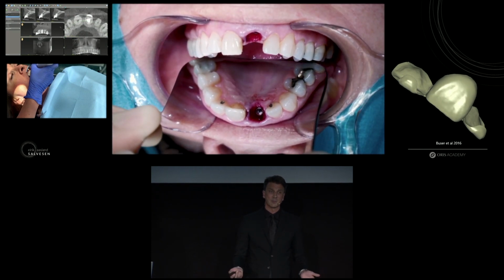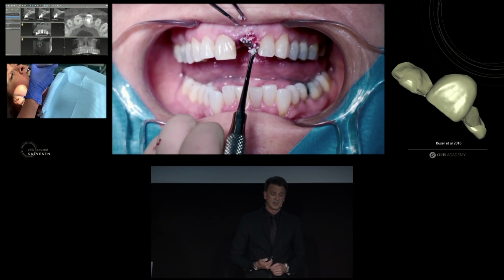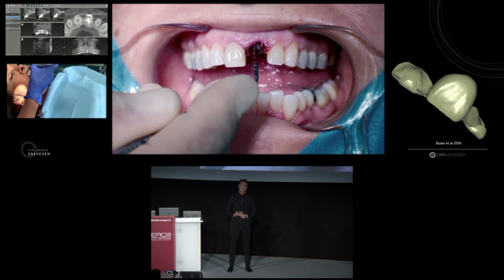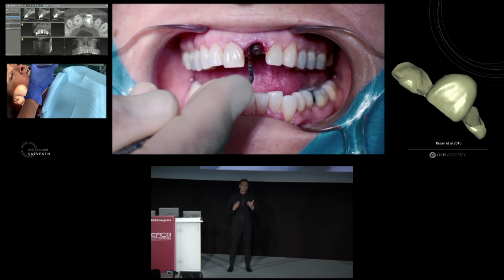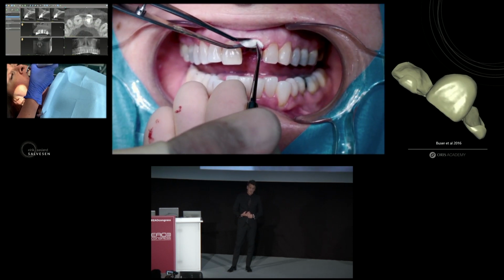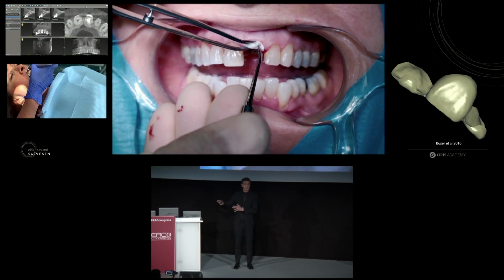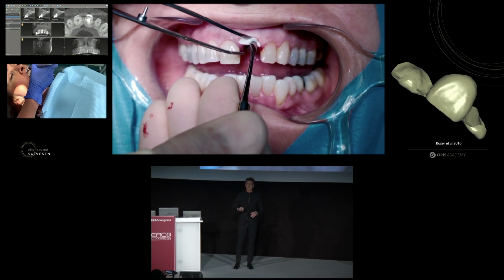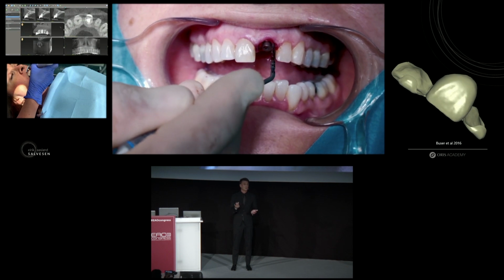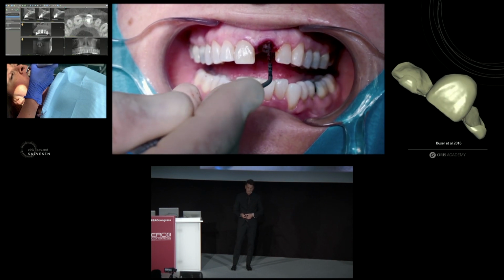And when we have the position of the implant on the palatal, which you will see focused during the whole afternoon now, then we have what we call slowly resorbable biomaterials. It's xenografts, and those will keep the volume of what is the aesthetic profile of the soft tissue. And you'll also see now a resorbable collagen sponge just put on top, just to keep my prosthetic and restorative colleagues away from my bone. So that one's just a protective one. And it's nice that Straumann now developed these nice surgical instruments, even to pack biomaterials. So it's small refinements, but it helps in the clinic and it helps in daily work.